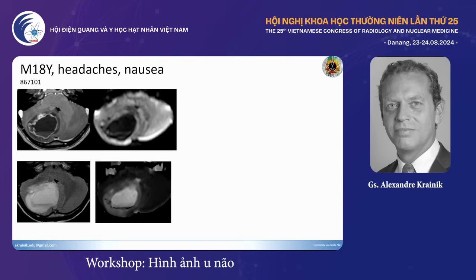Well, when you have such a lesion, when you're older, you can always discuss metastasis, because metastasis can look like anything. But when you're 18, we mainly discuss two diagnoses. One, a large cyst with an enhancement, is roughly pilocytic astrocytoma or hemangioblastoma. And then perfusion is very helpful to distinguish those two. Despite those two being benign lesions, okay?